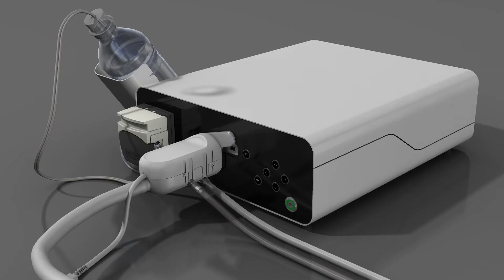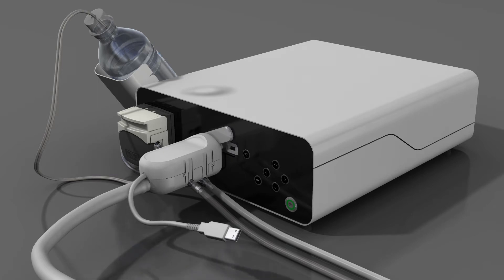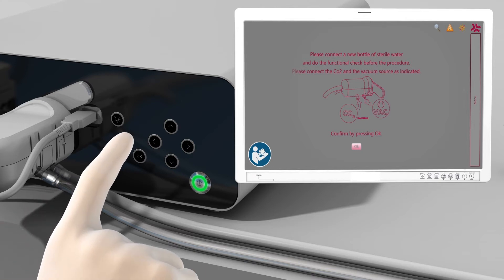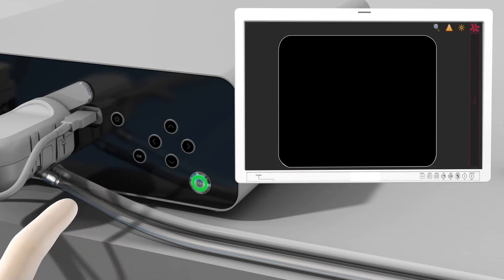Plug the A-Scope Duodino's USB connector into the A-Box Duodino. The system will now display the message: preparation for examination. A few moments later, the system will display a graphic with a reminder regarding scope connections. Confirm that the A-Box Duodino is ready for use by pressing the OK button on the front panel. The system is now ready for use.